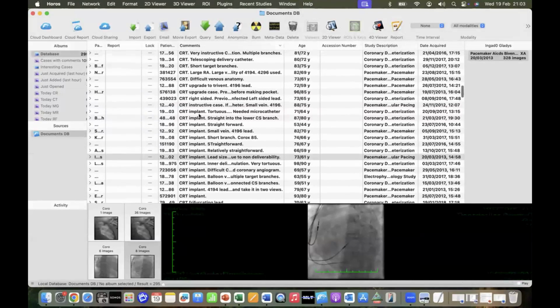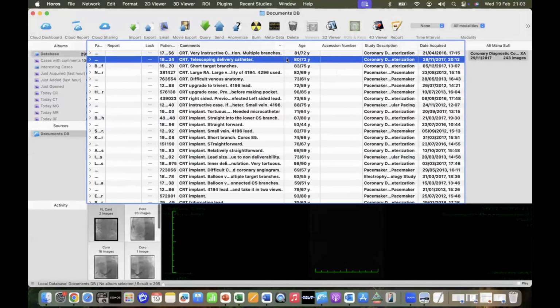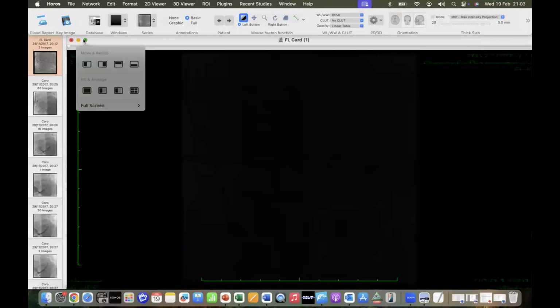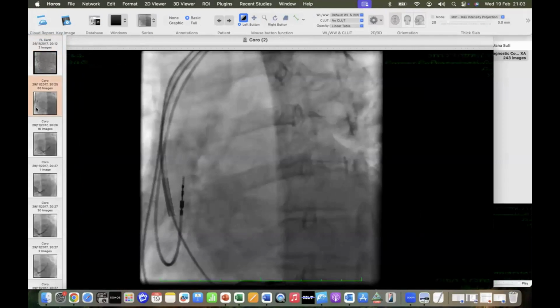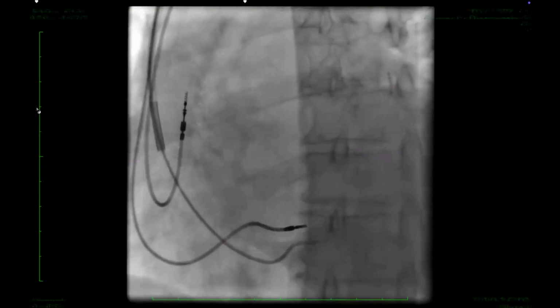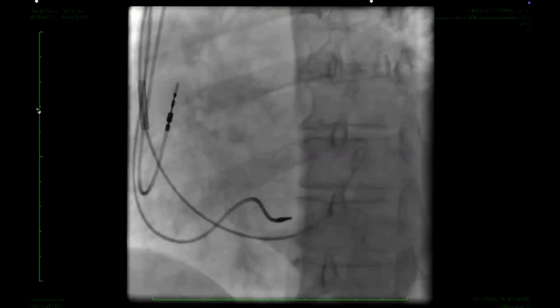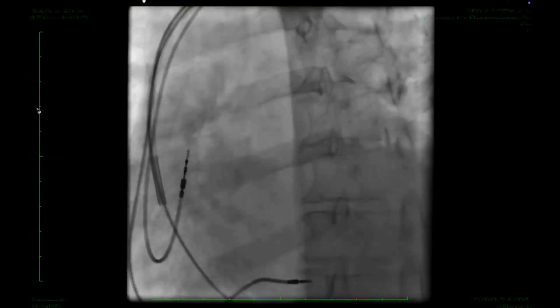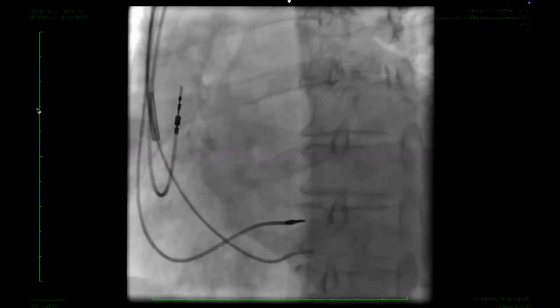There are lots of CRT cases. Well, let me use a telescopic delivery catheter, the subselect catheter. Let me show one of those. So here we have the Amplatz sitting right in the mouth of the coronary sinus. And again, we've met another Thebesian valve. I'll let that play a third time.